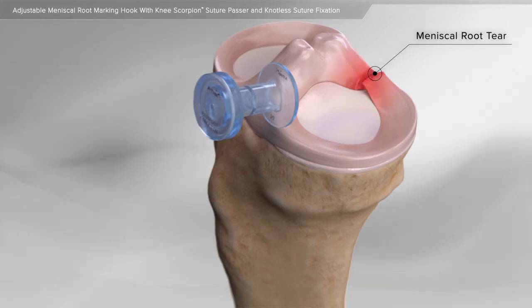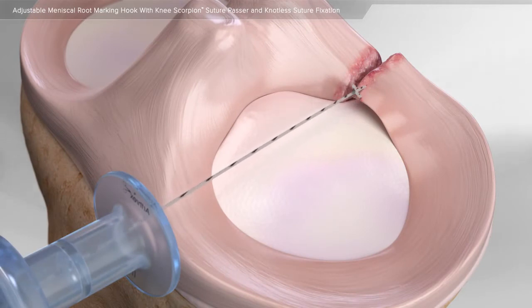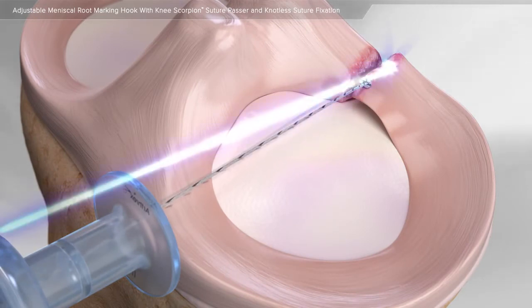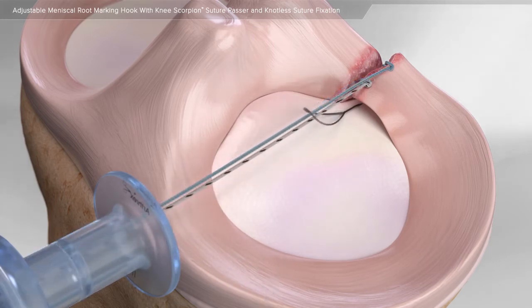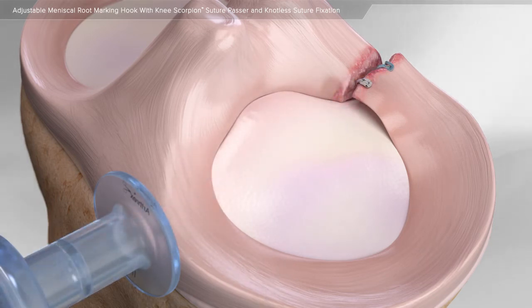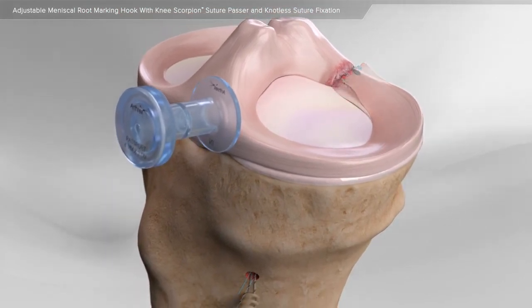Your surgeon will determine if the meniscus tear in your knee can be repaired surgically. Through minimally invasive surgery using a small camera, surgical instruments are used to place sutures through the meniscus root. Once the sutures are passed through the injured tissue, they are pulled through a tunnel made in the bone and fixed using a screw-in type anchor.